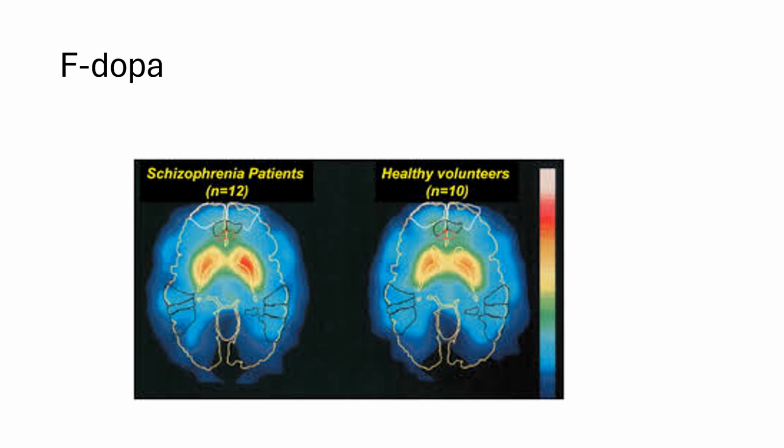And this is FDOPA evaluation for schizophrenic patients. The cool thing about that one is it doesn't require as much keeping the patient quiet and understimulated for the uptake period because it's not associated with glucose metabolism. So if patients are unable to do that, then this is a better test for them.